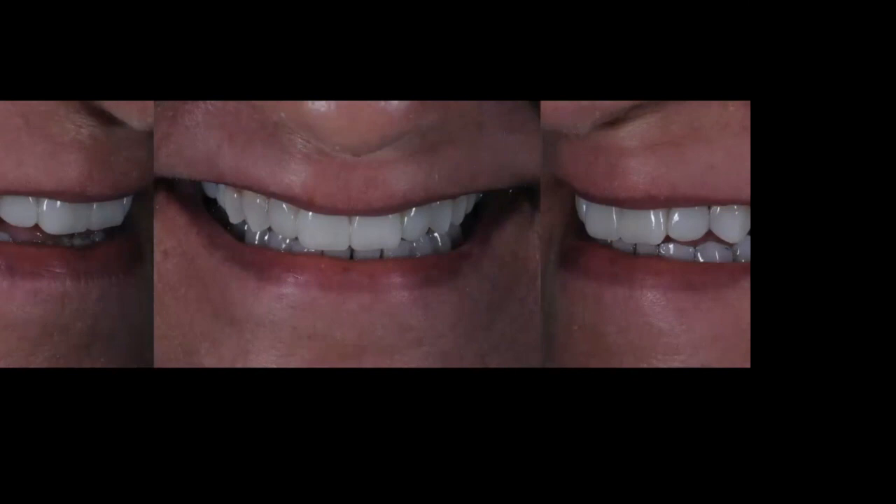Right away I can evaluate the patient's smile — the immediate improvement is visible. Not only does this serve as a mock-up aesthetically, but I can have her smile, hold a conversation, adjust the occlusion, and ask functional questions: Does it feel weird to have longer centrals? Does it interfere with speech? Does it bother the lower lip? All these can be addressed and altered immediately in that same appointment, then I send the patient home.